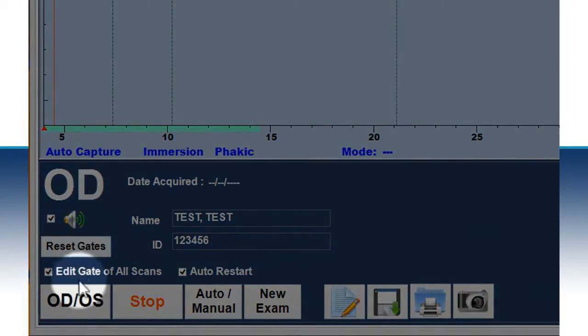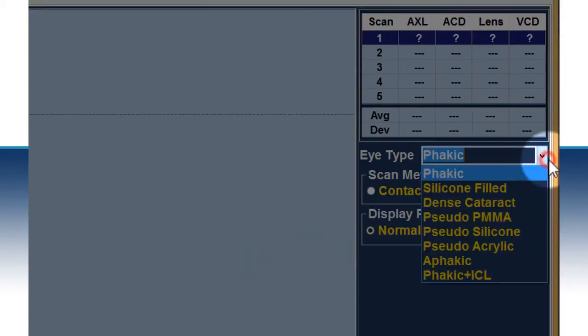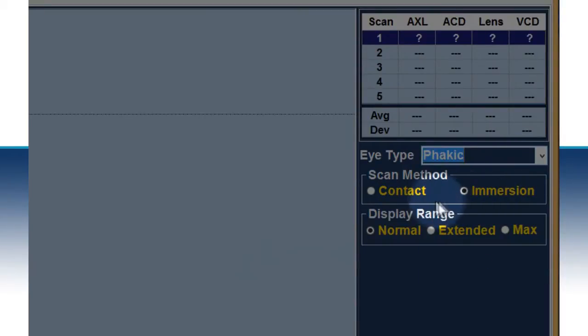Confirm that the proper eye is selected, the proper measurement type is selected (auto or manual), the correct eye type is selected, and also that the type of scan is correct.